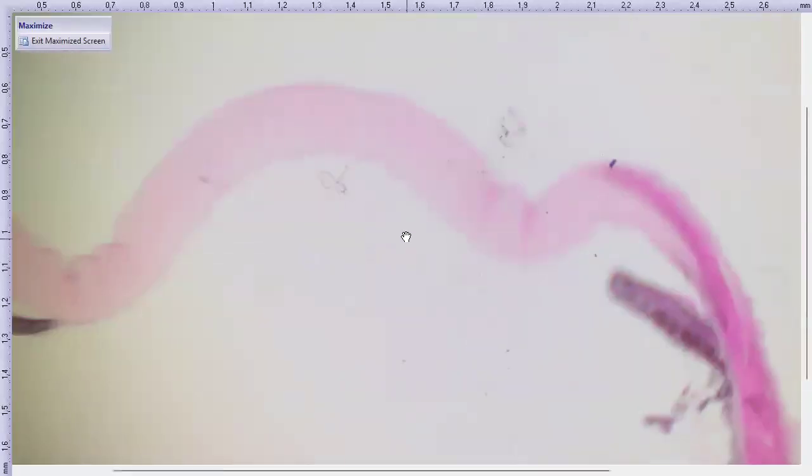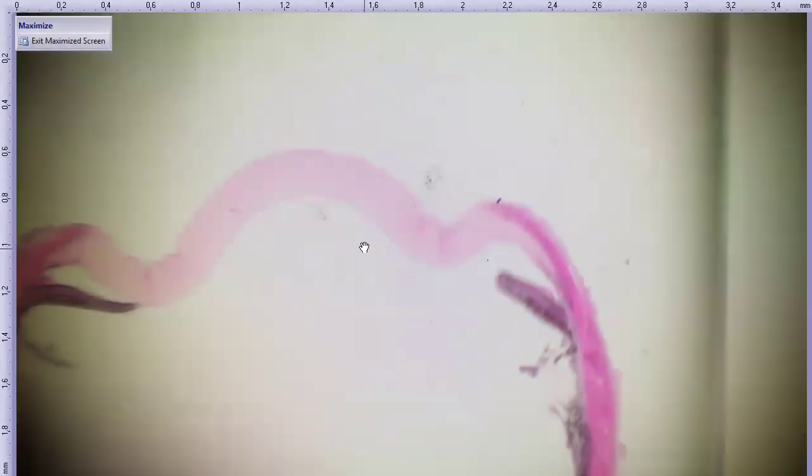Red spot here. This looks so. Oh, I bet I know what happened. I'm still zoomed in from when I was showing you guys the microsporidian. Haha. There we go. Now we can see most of the globe.